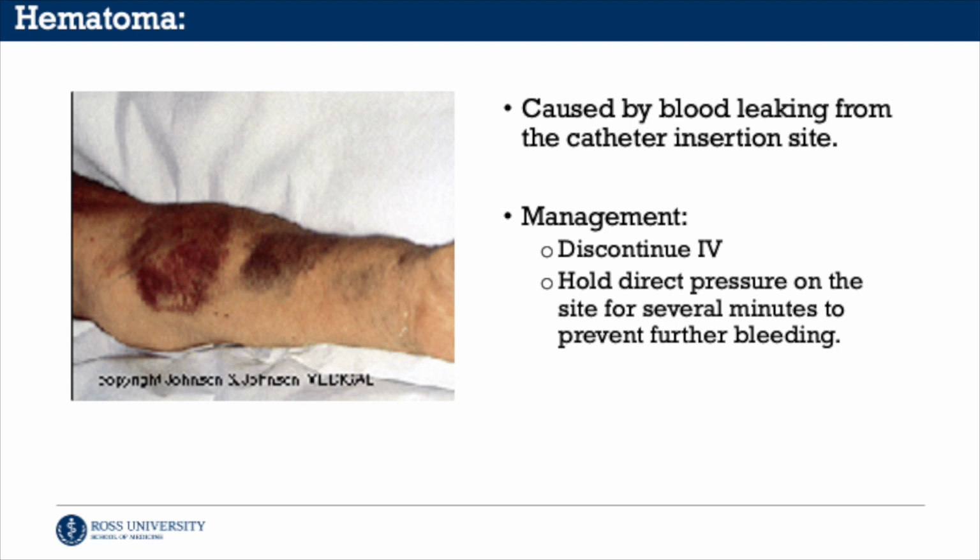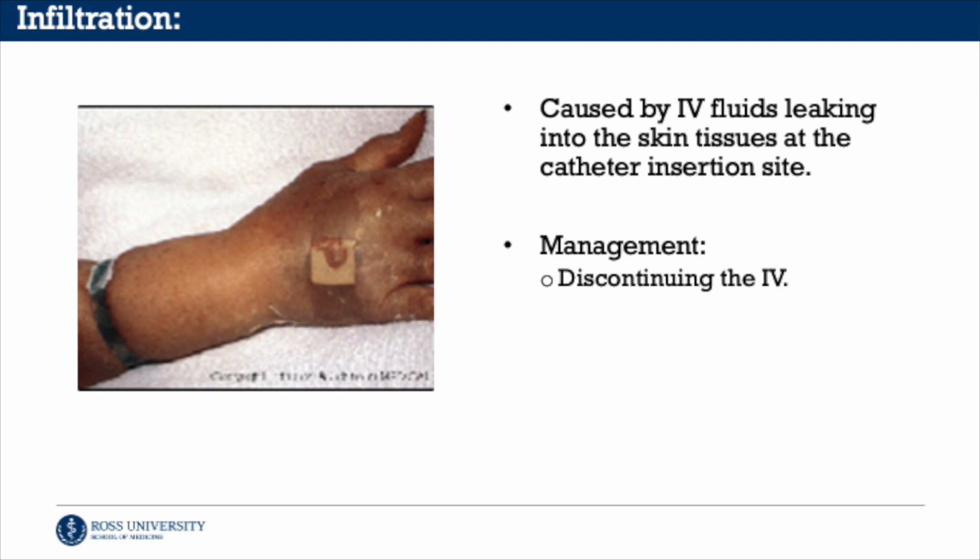You could also have an instance of infiltration, which is caused by the IV fluids leaking into the skin tissues at the catheter insertion site. Management here is also to discontinue the IV.